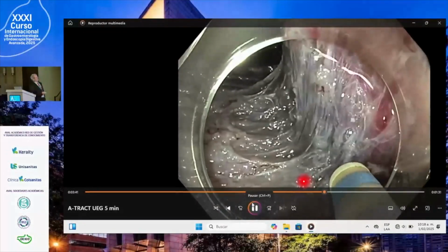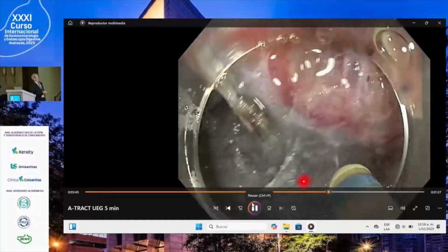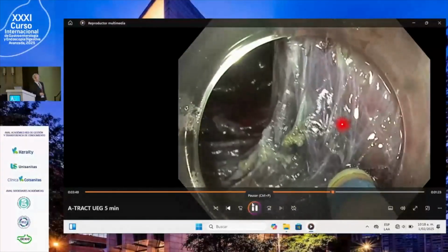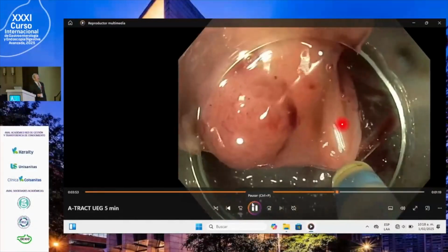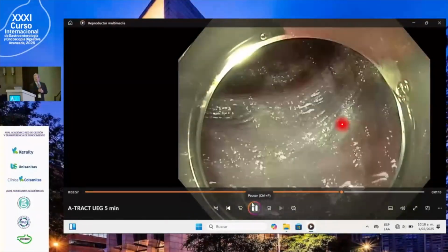You see? You have no problem seeing where the submucosa is, and you have no problem seeing the muscular layer on the left and the mucosa. So this system is quite helpful. Rubber band is helpful, but when you can adapt the traction, it's more helpful. Okay.